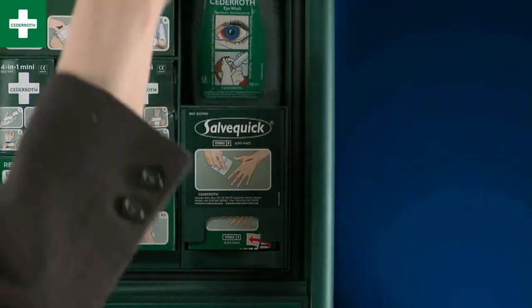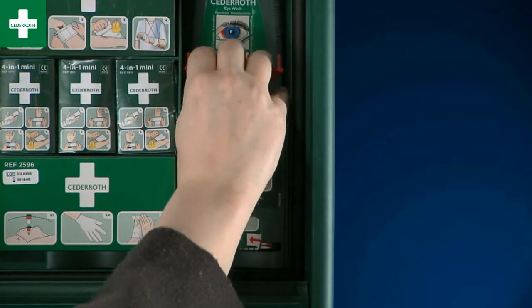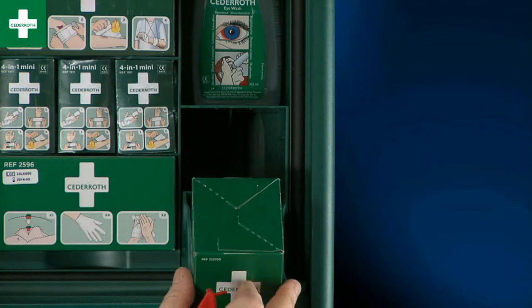When changing the wound cleanser refill, use the same key but upside down. Push down the two pins in the hole above the wound cleanser holder and the refill is easily removed.